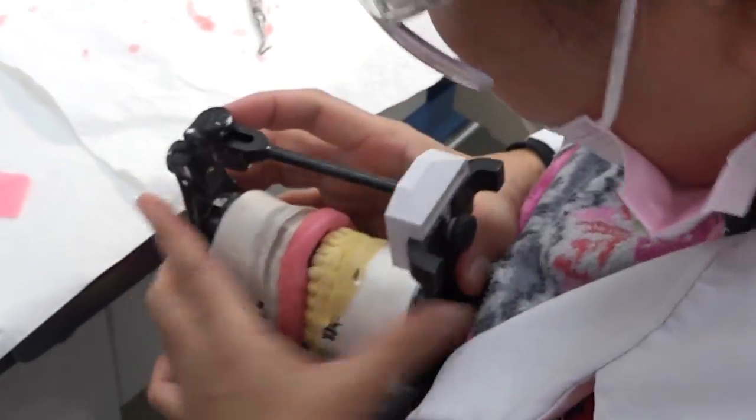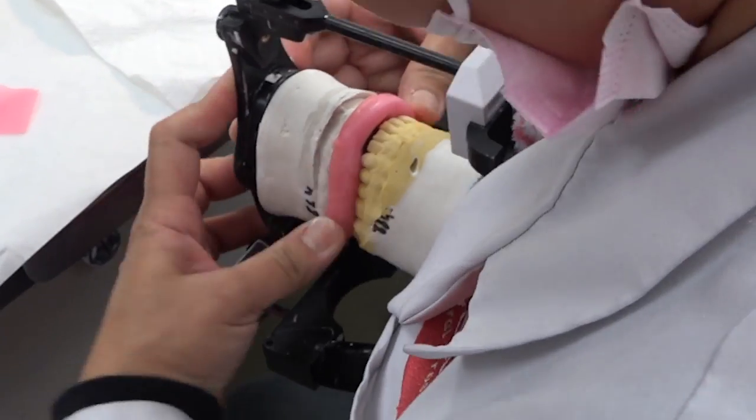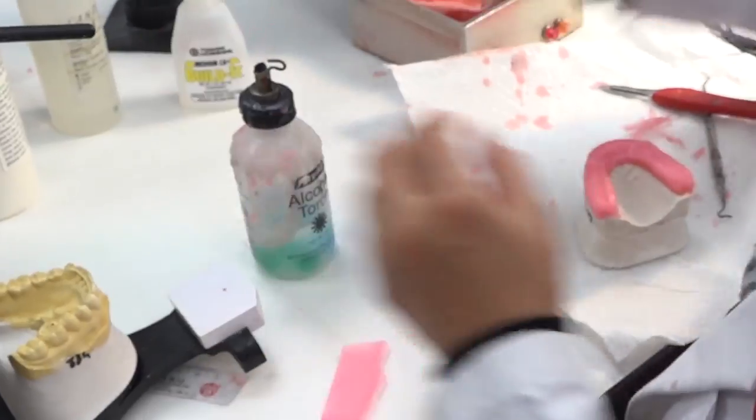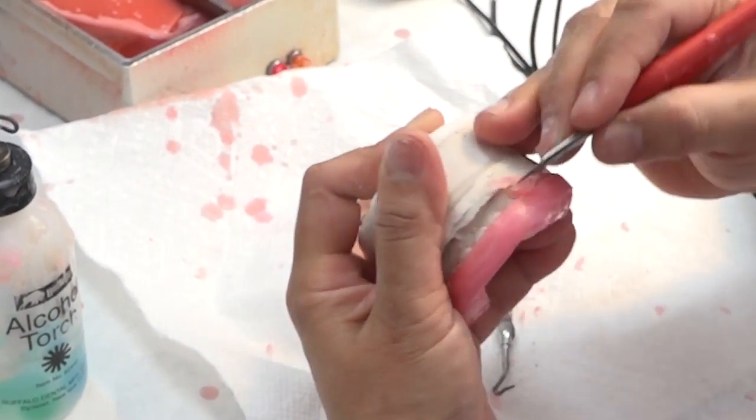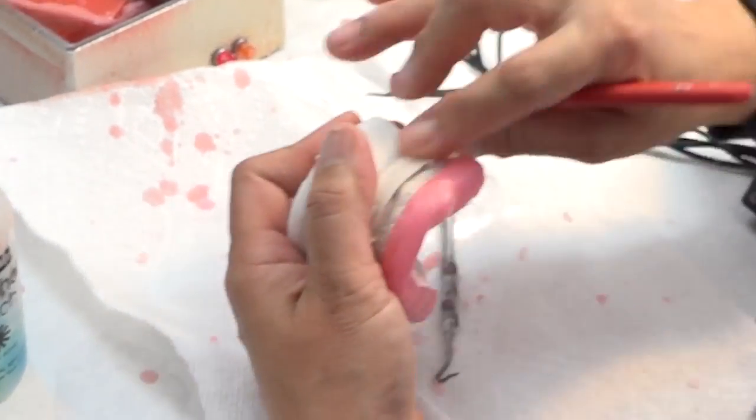Layer in smooth wax to the right thickness so the bite is closed. Cut the wax to create the edge of the night guard, about two-thirds of the way up the teeth.